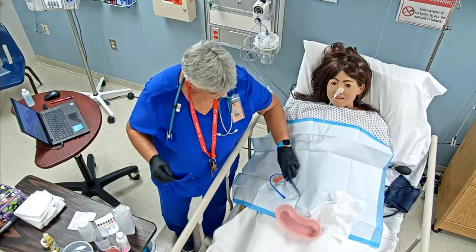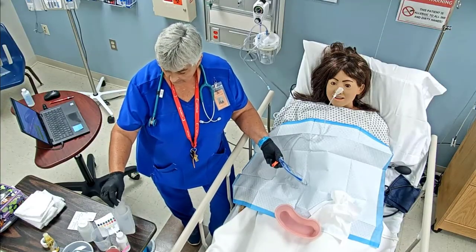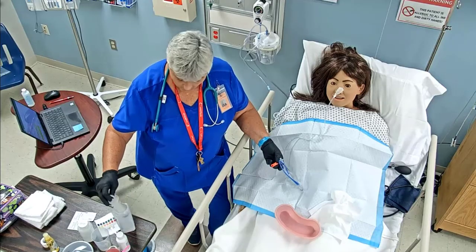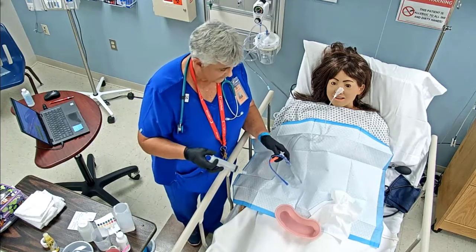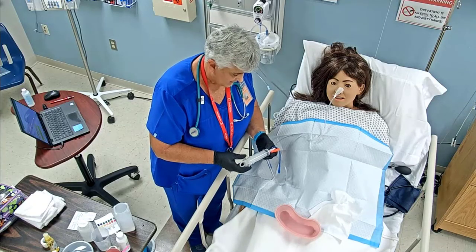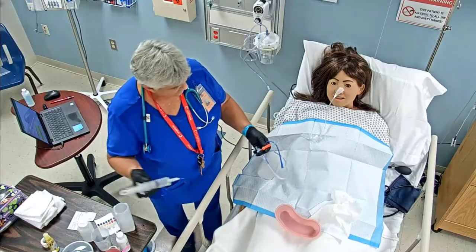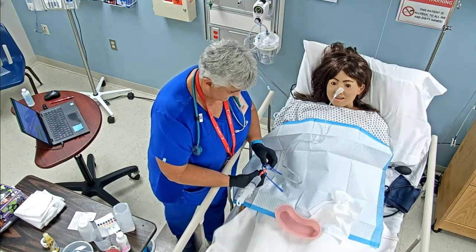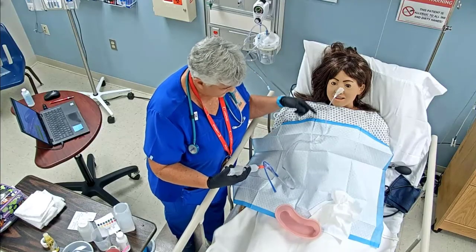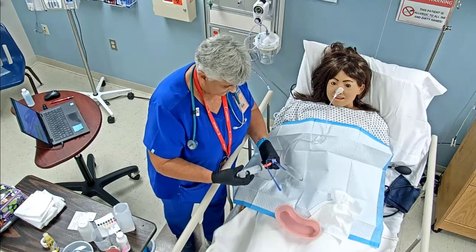Since we've done that, to flush it we can either use our sterile water, at least 10 mils, or we can flush it with 20 to 30 mils of air. Let me find my 10 mils there. Actually, we're going to do 40 of air. I'm going to connect that back and open that, so we've got the open area there. We're going to flush all of that out, so we don't have any in the tubing when we get ready to remove this.